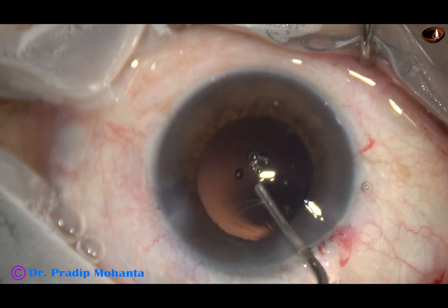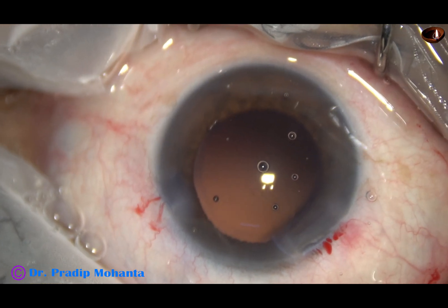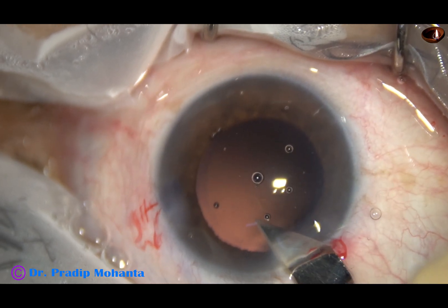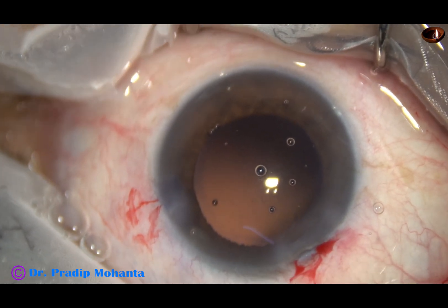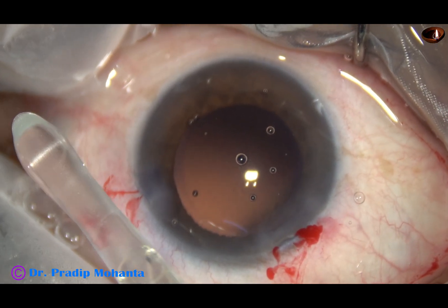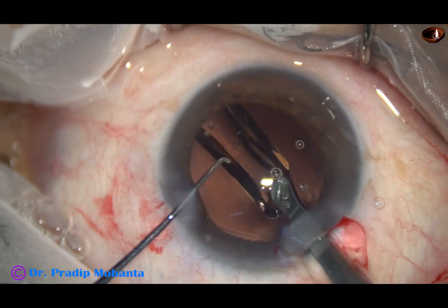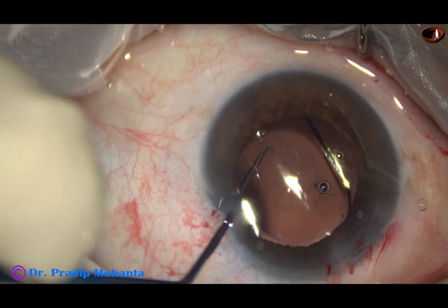This is visco. I am going to implant the lens, filling up the bag and the anterior chamber with visco. Enlarging the main wound, because I am going to use a B cartridge. And now, here goes the intraocular lens. The lens has gone into the capsular bag.